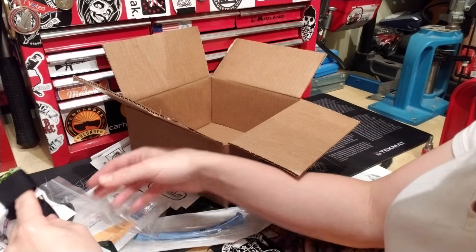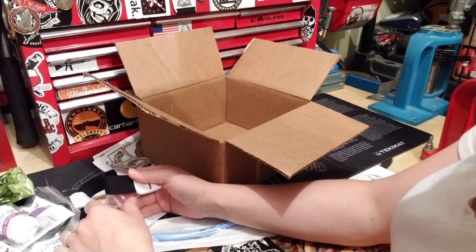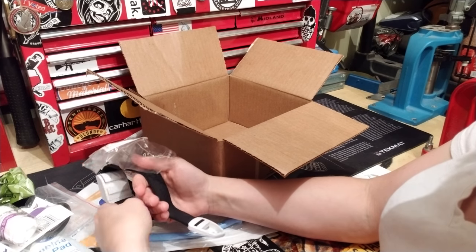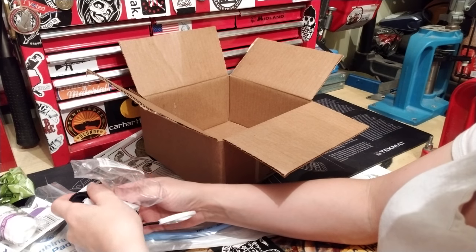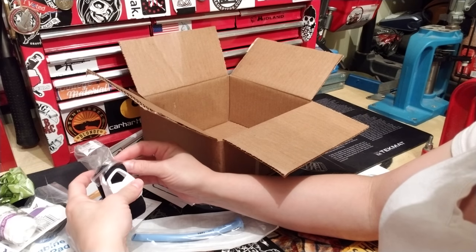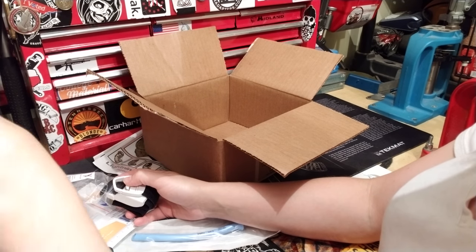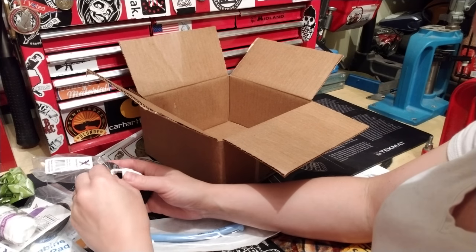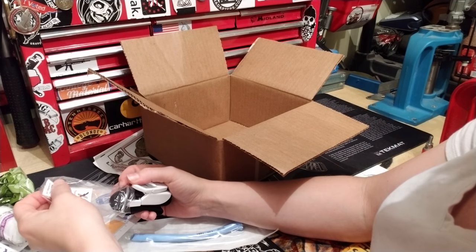Overall it's a pretty good trauma kit. The main thing I'd add is antibacterial cream, petroleum jelly, or something for a sucking chest wound. You can improvise with saran wrap and three strips of tape applied on three sides — no need to spend an extra $10-$15 on a dedicated chest seal unless you prefer the convenience.